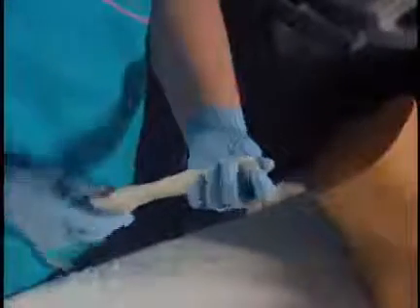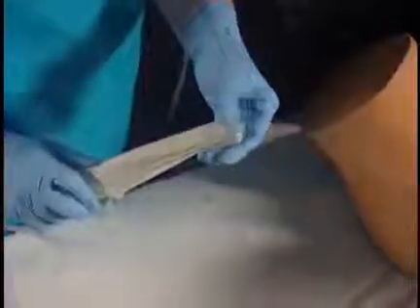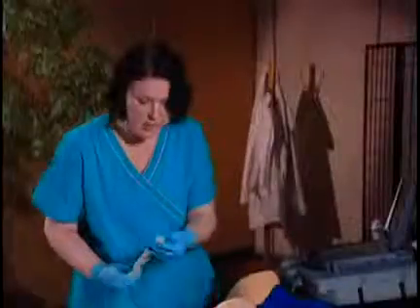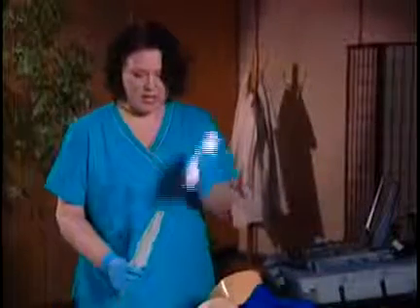And then just make sure that you examine the tip here and make sure you eliminate any air bubbles that are covering the transducer face. So once you've got the air bubbles eliminated, then you can move on to the next step. We're going to put a little bit of gel on the outside of the latex cover now.